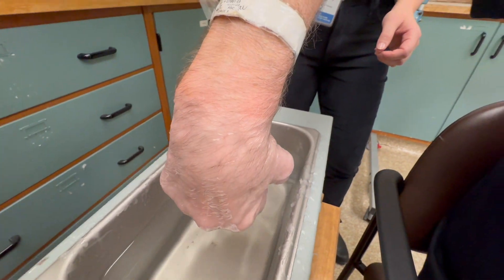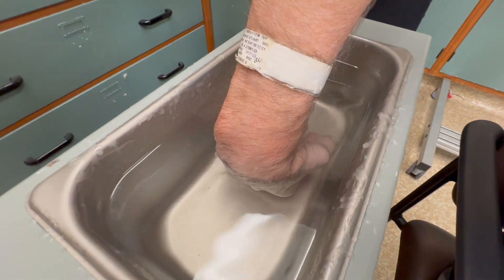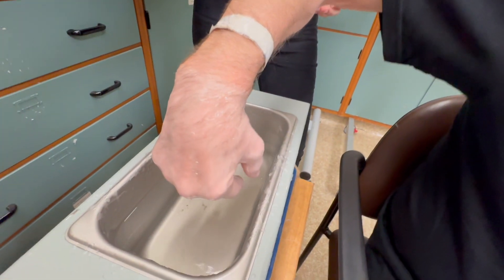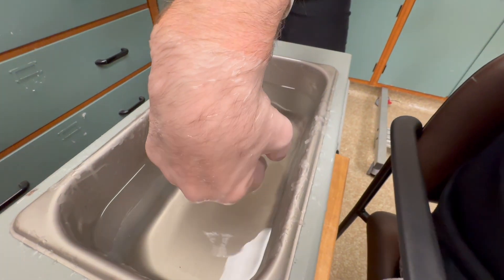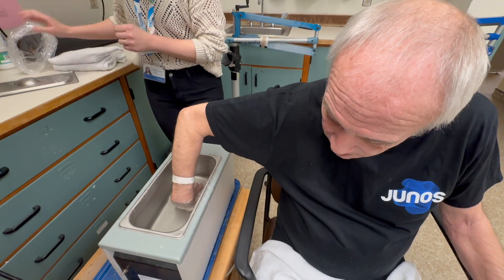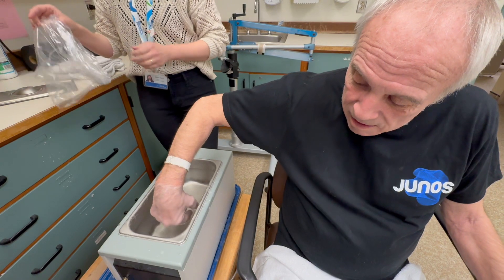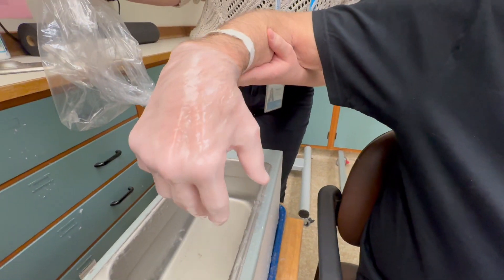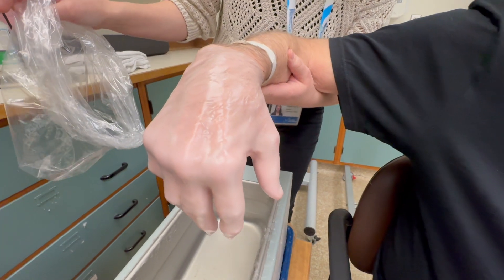How does it feel? Warm. Warm and nice. This is something everyone should have at home, but I understand most people won't. Just gonna let that drip and harden before we put the plastic on.